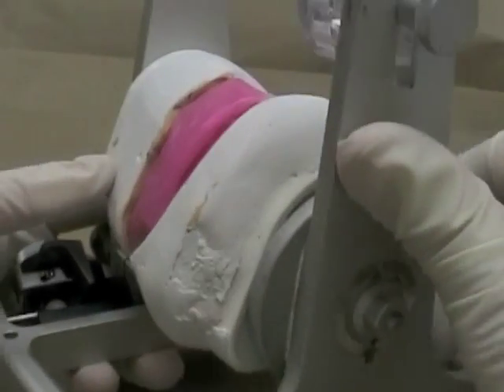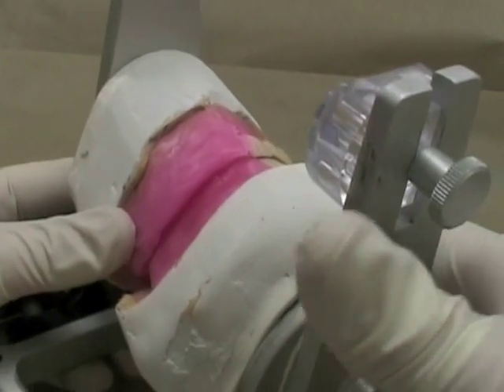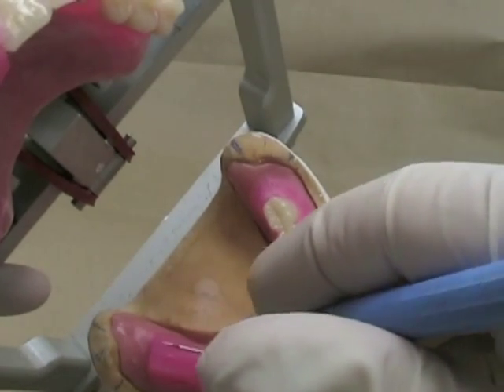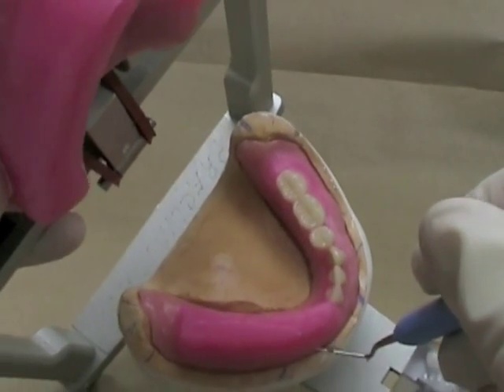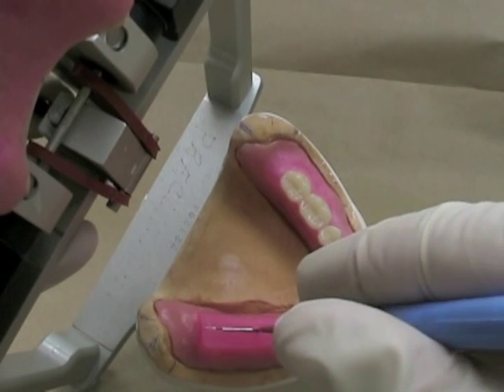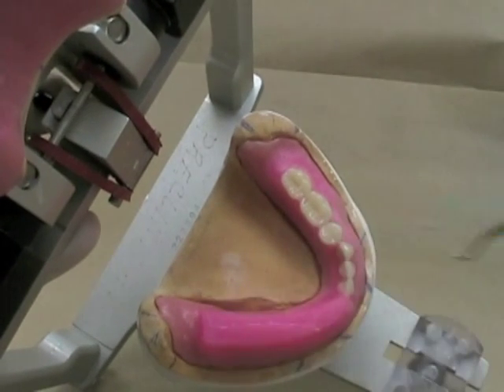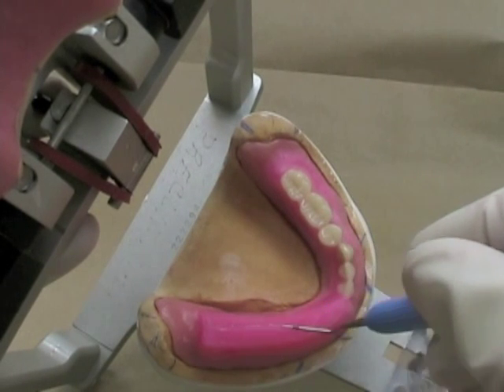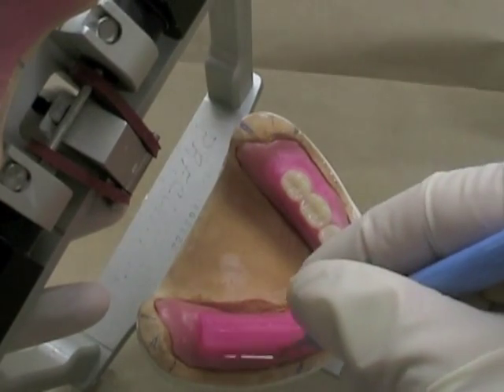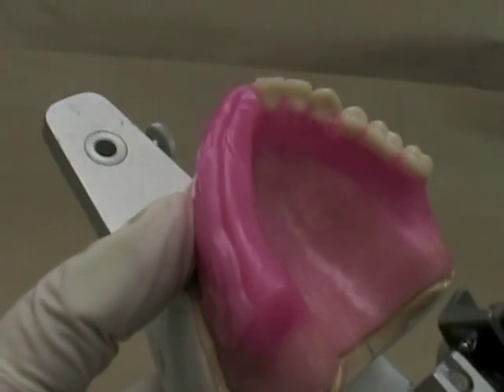Before you add wax to any particular rim, you want to check that you're close to having the rims where you want. In this particular case you can see in the mandibular rim that I've got the center of the ridge. Looking at my reference lines, they're running pretty much where I want them to be — I want the maxillary lingual cusps along the center of this ridge. Here are my reference lines on the cast and I've drawn a line on my wax rim. That one's maybe a little bit buccal to the ridge, but I certainly wouldn't want to build this one out any further. Therefore, in the maxillary arch, that's why I've added that wax to the upper rim.